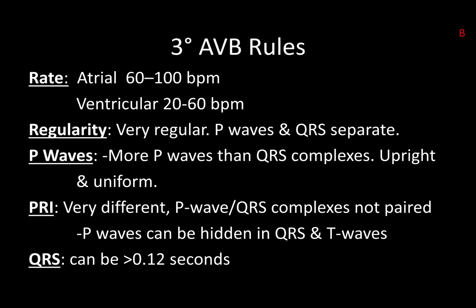What are the rules for third degree AV block or complete heart block? There's a couple different things that we wind up calling it. I'll usually call it third degree most of the time, because there's only one thing that we really talk about, at least without being in a burn unit. Anyhow, what you're going to see is this. The atria are going to be clipping along at a nice normal rate. There really shouldn't be anything too exciting going on in terms of the number of P waves and the rate that they're moving.